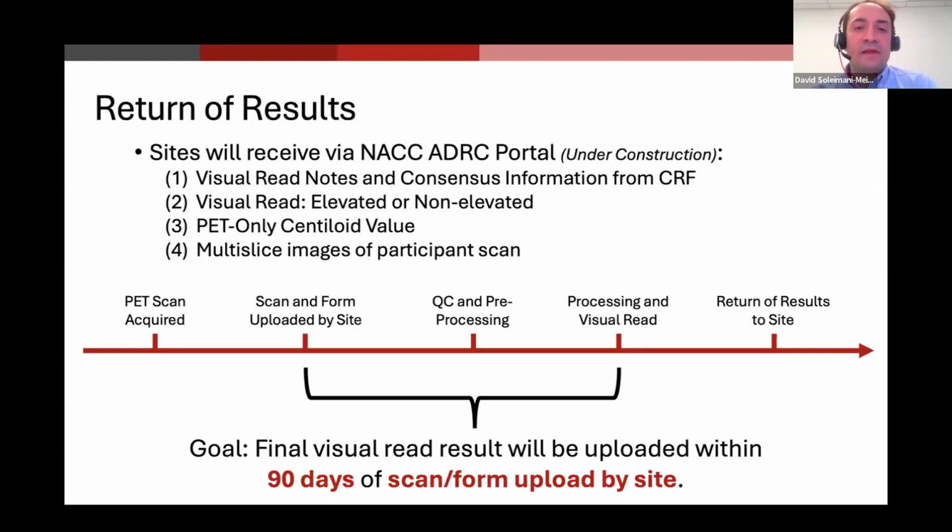And again, it's very critical to mention this again. Please make sure to upload your amyloid PET scan and associated forms as soon as possible, because the 90-day countdown for returning the visual read doesn't start until this data is uploaded. Next slide.